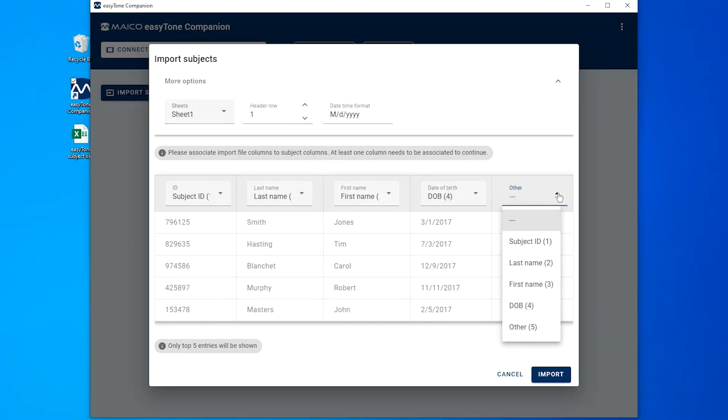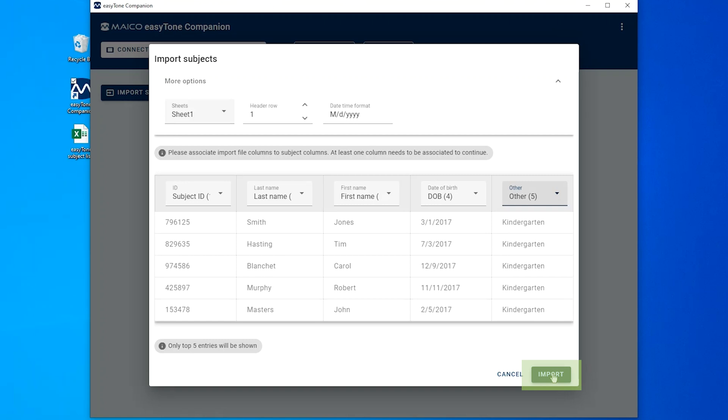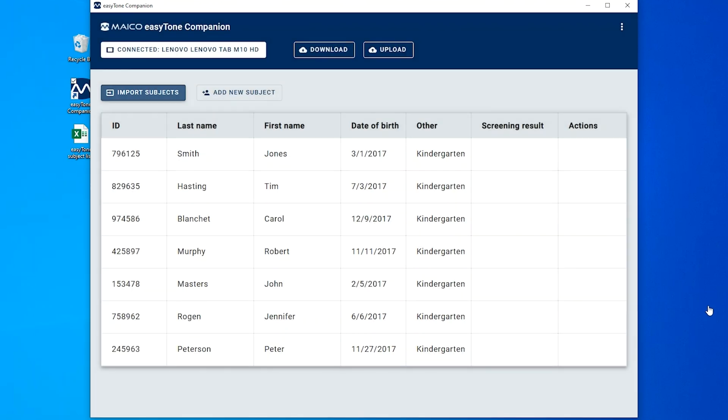When association is done for each necessary column, select Import. At least one column needs to be associated to continue.